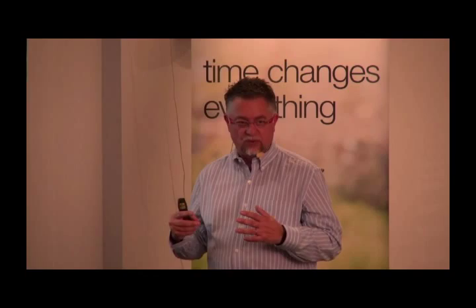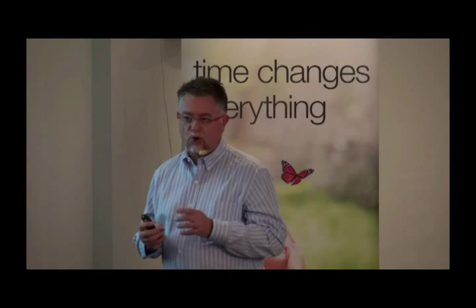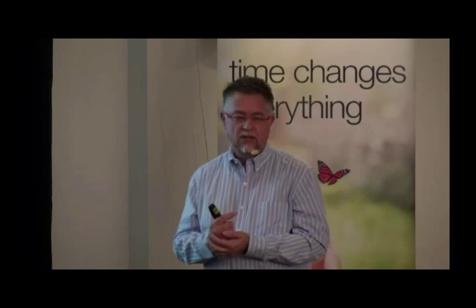So I'm gonna show you the CBC in a second, but first I want to remind you of something. So you've seen this graph before, and I told you those are neutrophils, those are eosinophils, basophils, lymphocytes, monocytes. Fluorescence increases as you go up, correct? So I'm going to ask you this. So if a dog has toxic changes or a left shift, all right? So remember, what is a left shift or toxic changes? You're skipping mitosis in the bone marrow. So you're releasing them before the cells are fully cooked, all right?